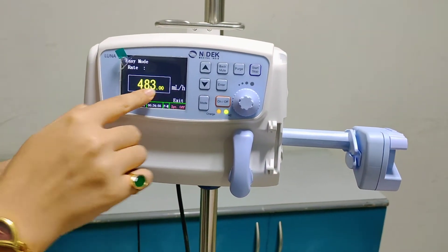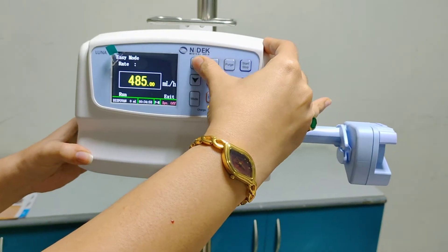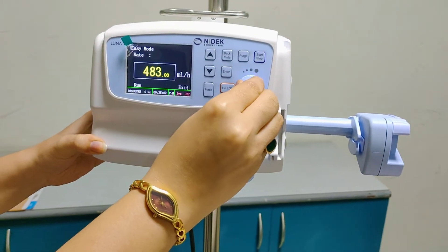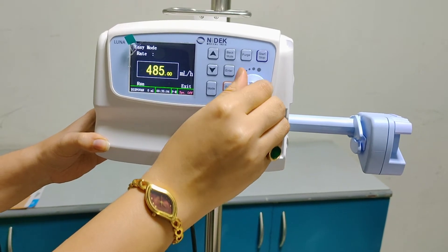This is the flow rate, which we can increase or decrease with the up and down keys. Or you can also adjust it with the trim knob.